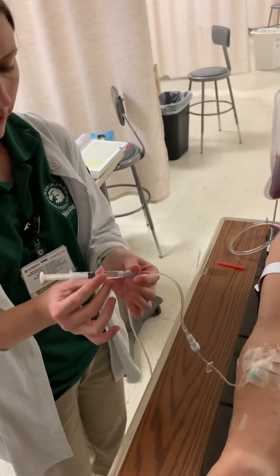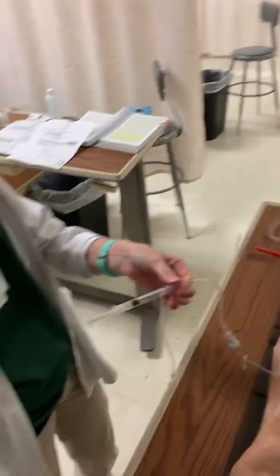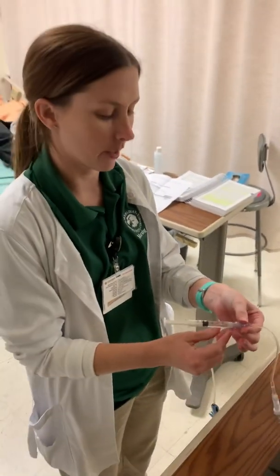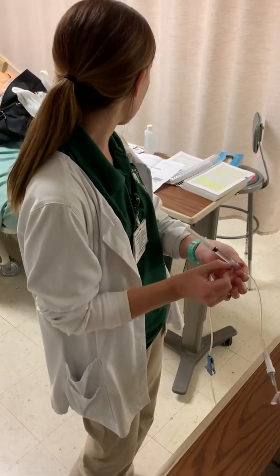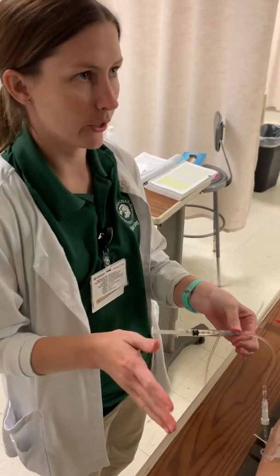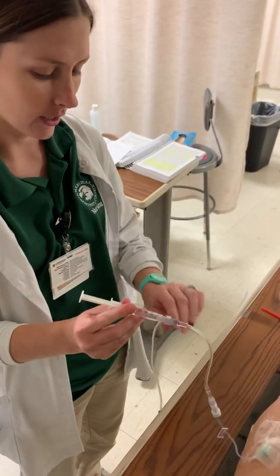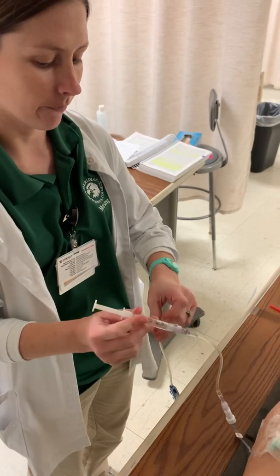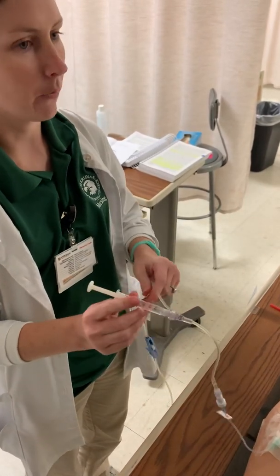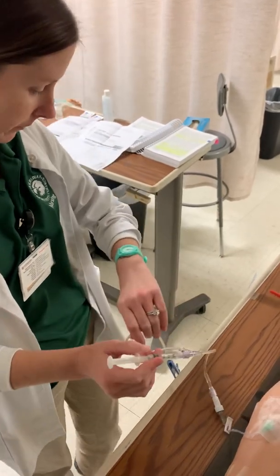All right, so I'm given 2 mLs, which means I'm going to be pushing 0.4 mLs over 1 minute. Because I'm giving it over 5 minutes, 2 mLs over 5 minutes, so I'm going to be pushing 0.4 mLs per minute. So while I'm pushing, I'm going to clamp off behind to disrupt the flow, and then whenever I'm done pushing, I'm going to release so it'll flush the medication through.